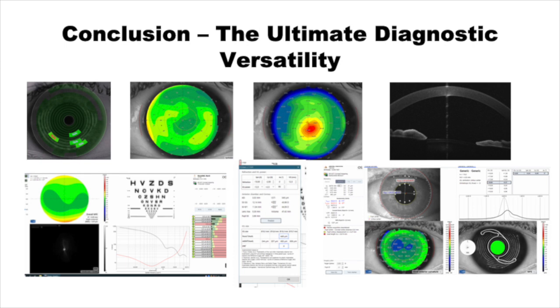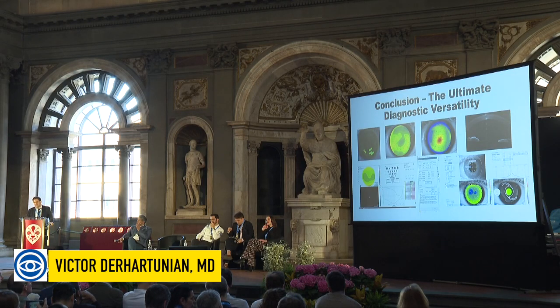We can see also the raw images of the OCT. And I think this feature is also underestimated among us. We should more often look at raw images in order to identify small scars or even map-dot-fingerprint dystrophy. In some cases, this needs to be treated prior to cataract surgery.